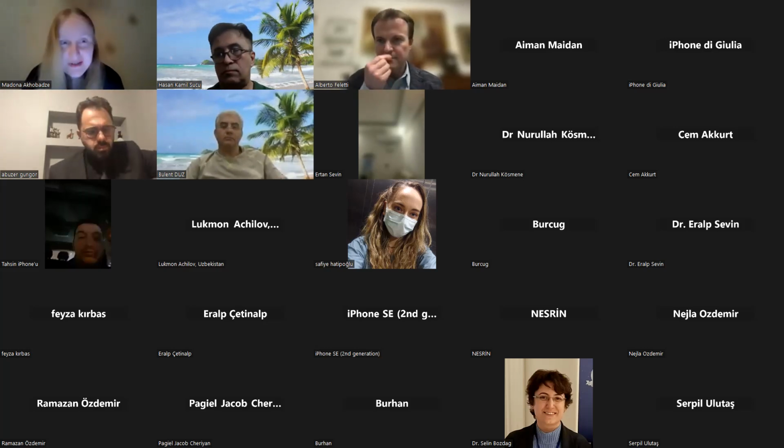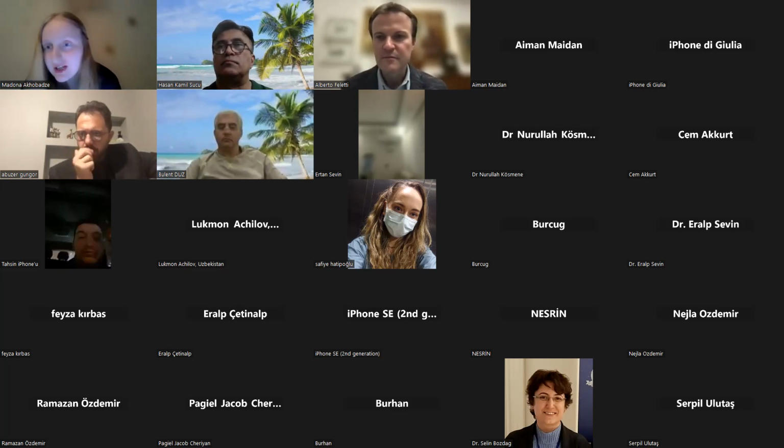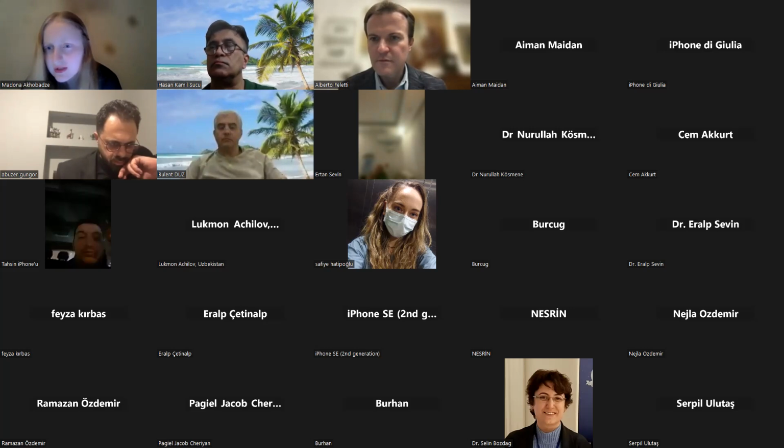Dr. Eralp, thank you very much for your response. I see one question appeared in the chat. Eralp Chetinalp from Çukurova University is asking, do you use a dry field technique when using Fogarty balloon compression, or is it CSF while trying to control bleeding?